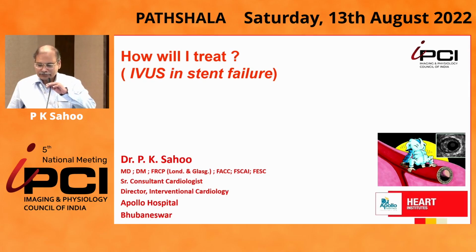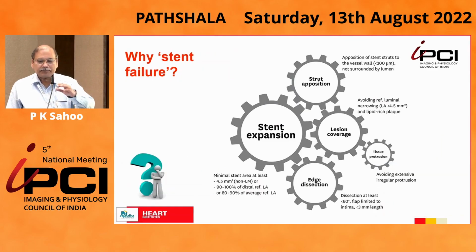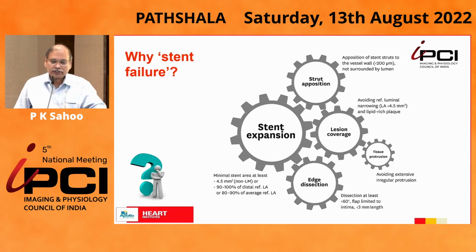Well, I thought I had to discuss the IVUS images. So anyway, I'll discuss in brief how to treat IVUS in stent failure. This has been projected since this morning: why does a stent fail? Basically, expansion problems, lesion coverage, edge dissection, strut apposition, all these have to be taken care of.